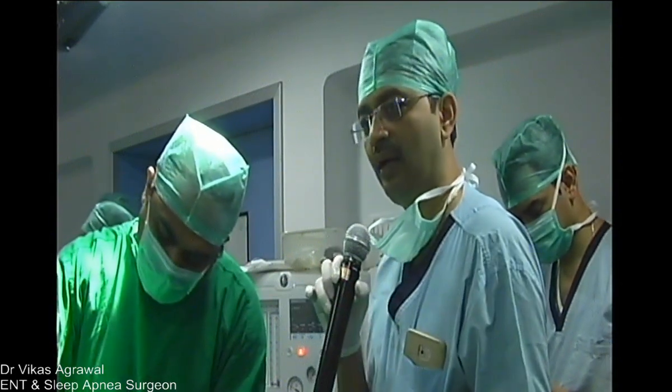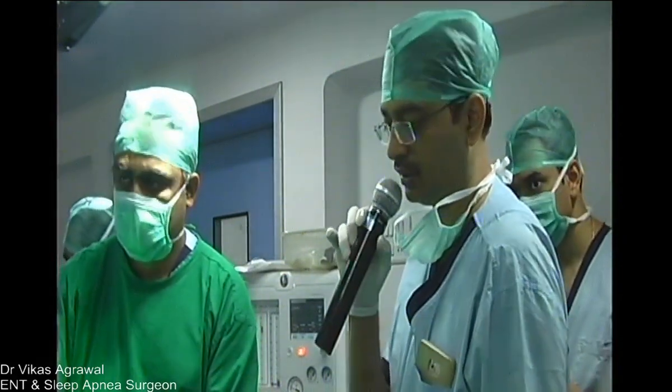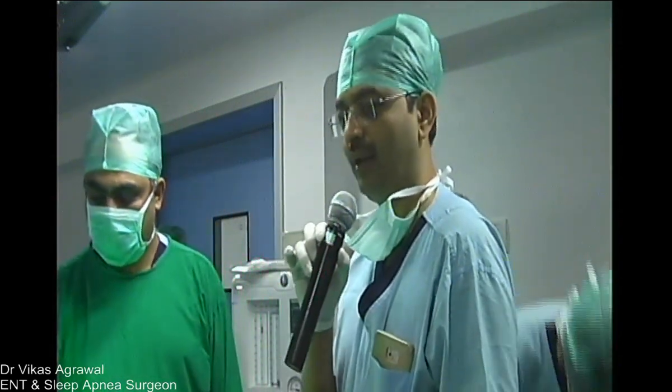We need to have a dry oral cavity, and we need to have a completely awake patient. These are the three factors we wait for, and we wait for the 5 to 7 minutes for all these things to happen, and then we extubate the patient.